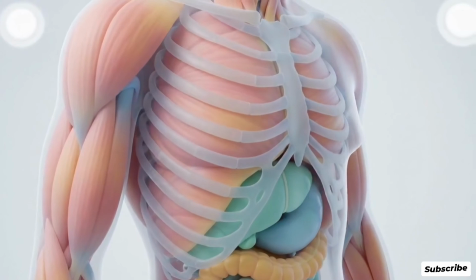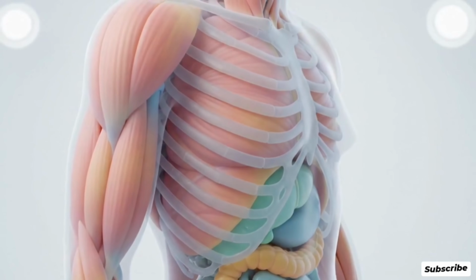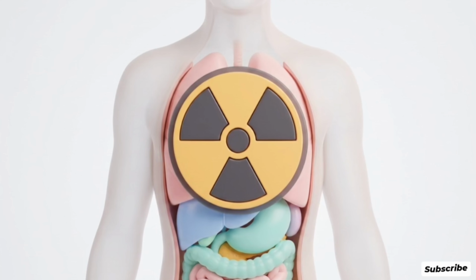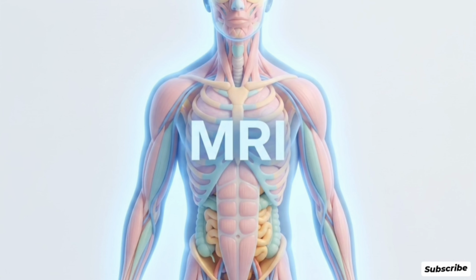But diagnosing a torn ligament, tumor, or brain bleed requires clear views of soft tissues. Pushing enough ionizing radiation through the body to map delicate organs is dangerous to the patient. Magnetic resonance imaging solves this problem by leaving harmful radiation out of the process entirely.